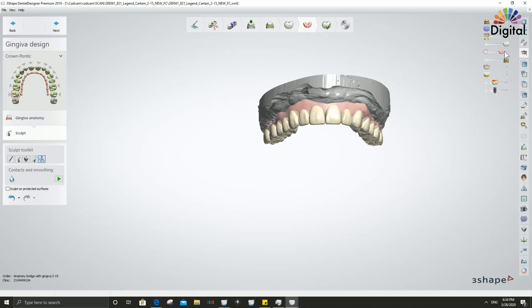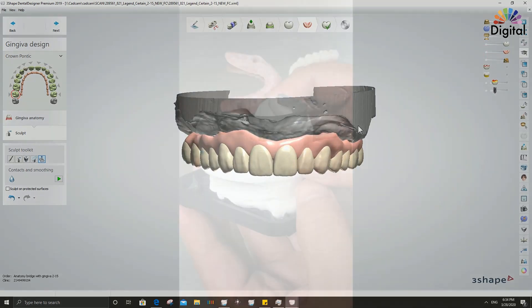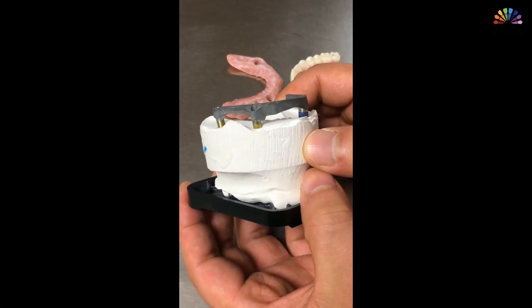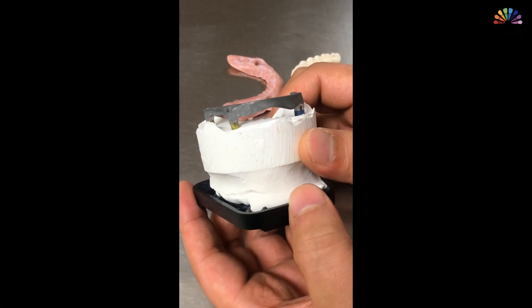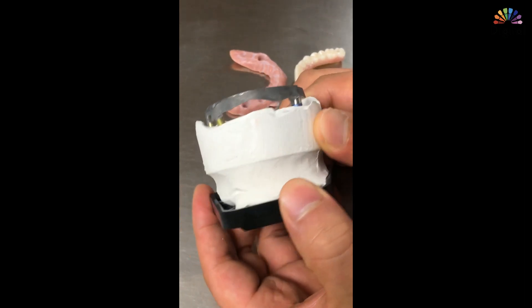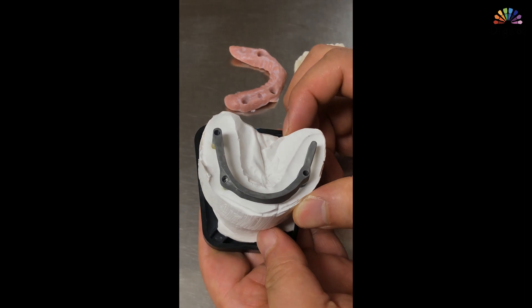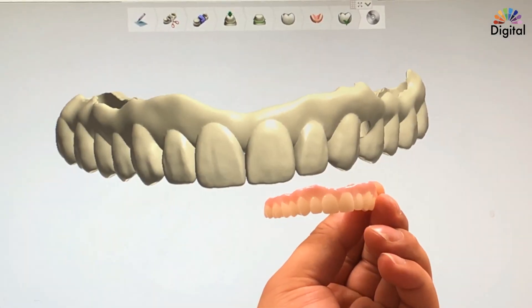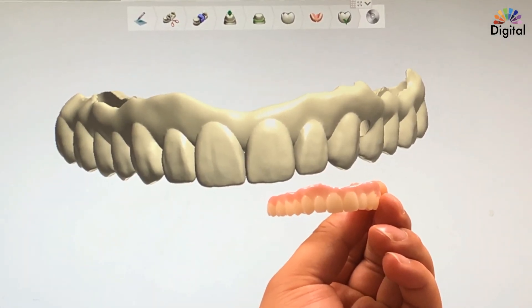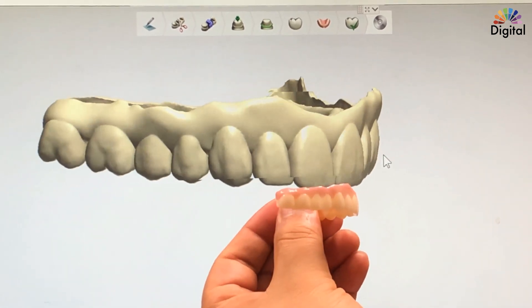Let's see how the milling quality comes out. The titanium bar fit check is super nice. The milling came out very nicely as well — the design is exactly as planned and the mill matches the same. Outside and inside both look very nice.